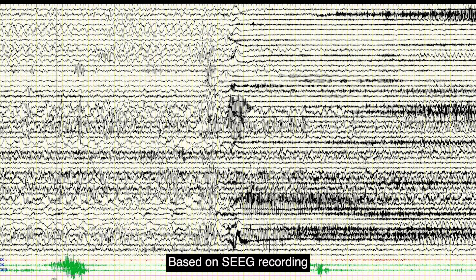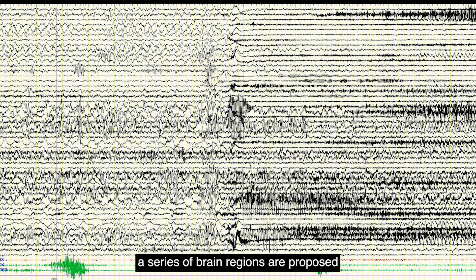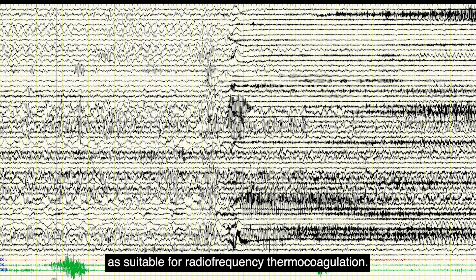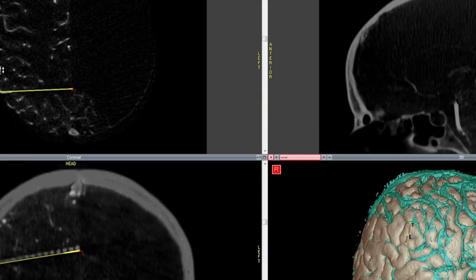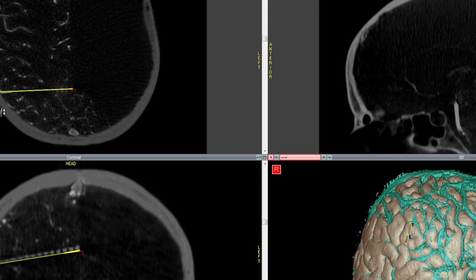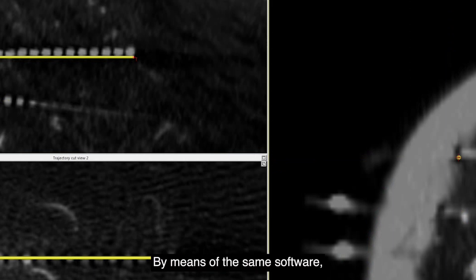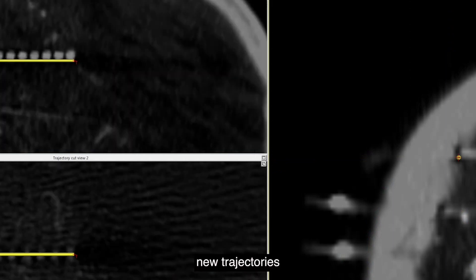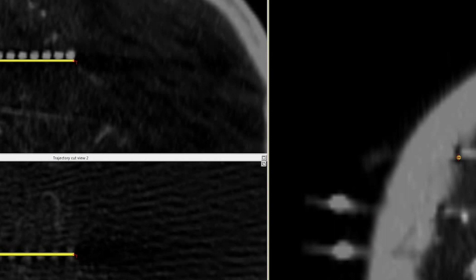Based on SEEG recorded for ictal and interictal activities and stimulation outcomes, a series of brain regions are proposed as suitable for radiofrequency thermocoagulation. By means of the same software, new trajectories involved in the hypothetical coagulating electrodes are defined.